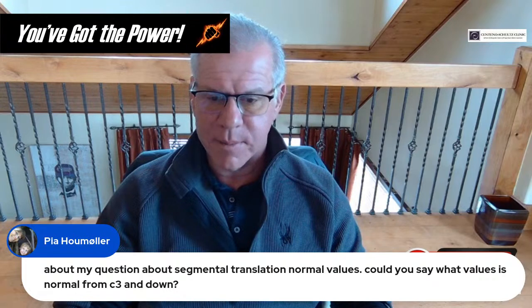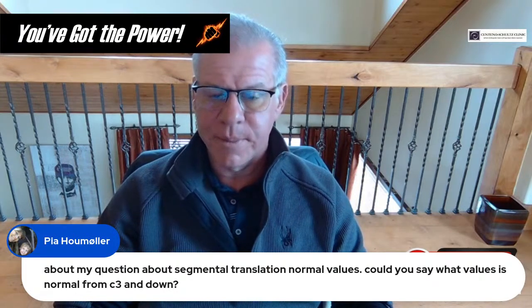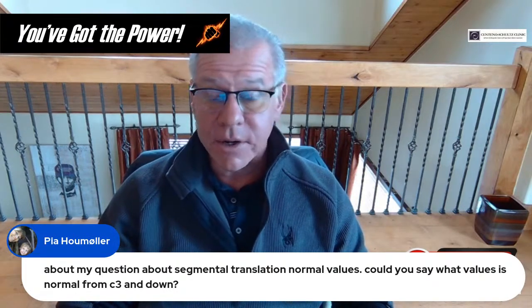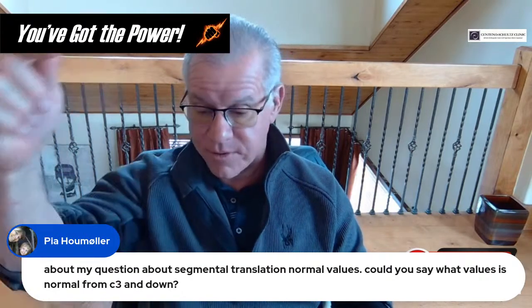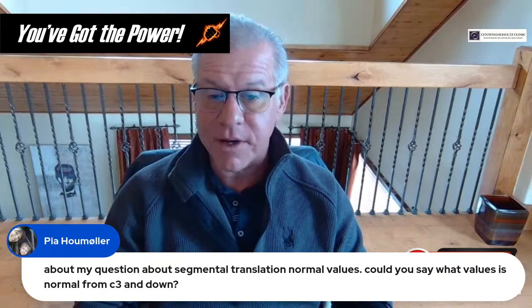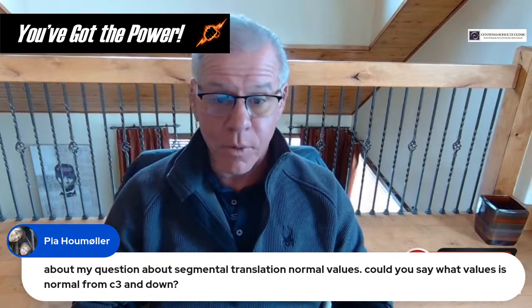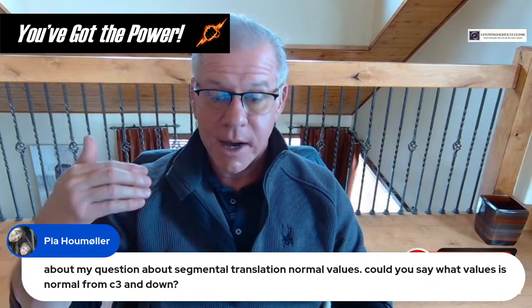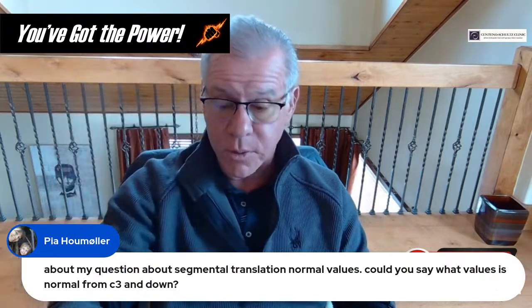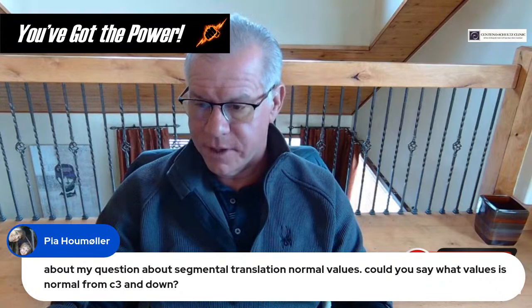Pia, about my question with segmental translational values. Yeah, Pia, so it's generally considered anything more than 1 millimeter at C2-3, and then once you get to C3-4 all the way down to 6-7, it's pretty much the same. Anything more than 2 to 3 millimeters of translation is abnormal. More abnormal when you get towards 3 and above.